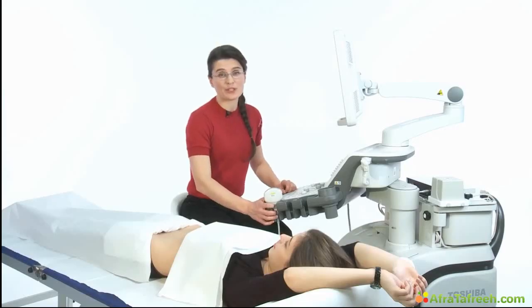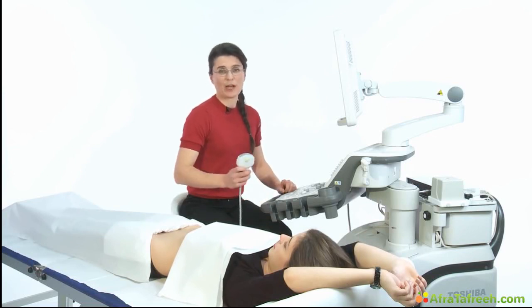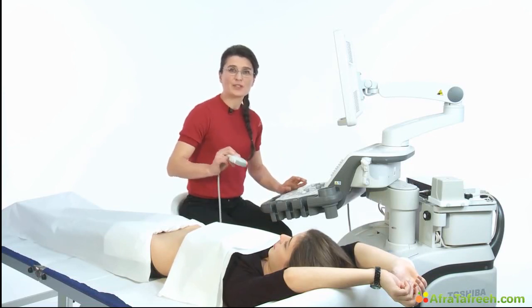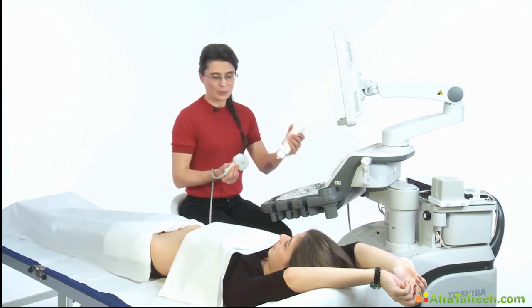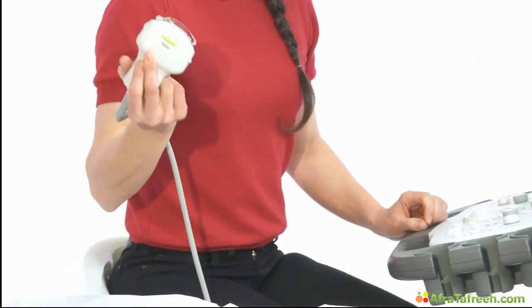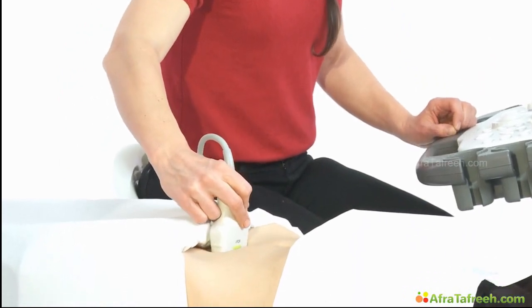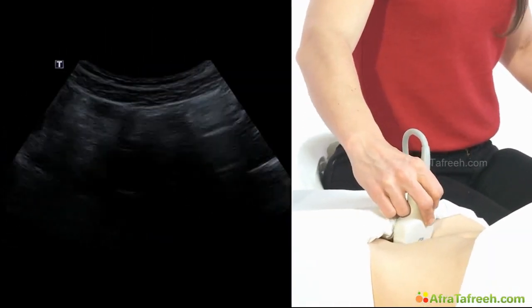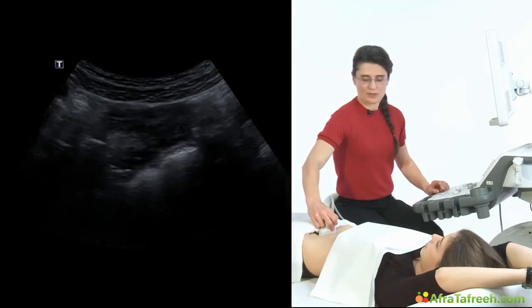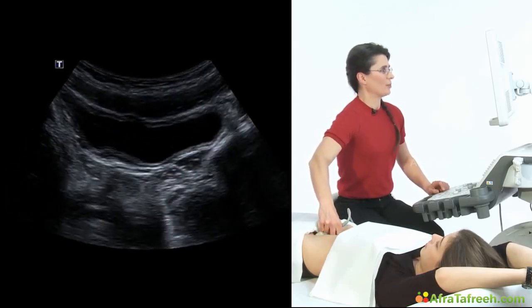And now I'm going to show you an ultrasound scan of an empty urinary bladder. This is not so easy in the beginning because the urinary bladder then is hidden behind the pubic bone. But I will show you how to tilt the transducer, and with some patience you will see you will succeed. Again, we apply enough ultrasound gel. I place the transducer at the lower abdomen, a few centimeters over the pubic bone. Again, the vertical mark is pointing towards me. And now you see I have to tilt the transducer quite hard to come behind the pubic bone.